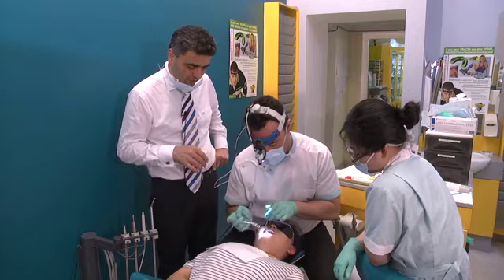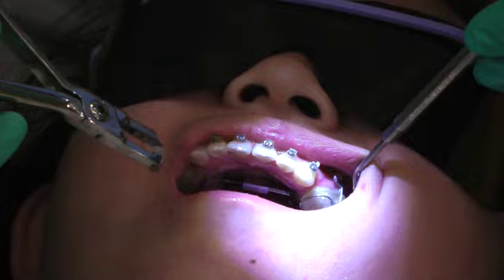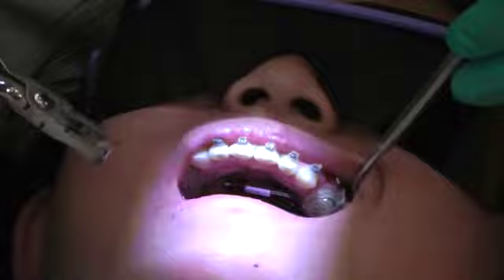Remember, there's more noise than actual drama. It almost feels as though someone's cracking a tooth in your mouth, but it's not — it's the glue. So then we move across to the other side; we've got that side cracked.